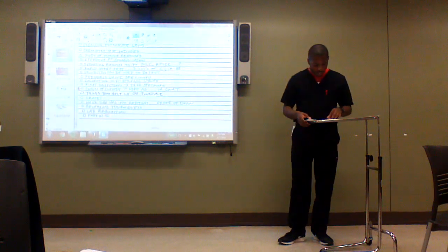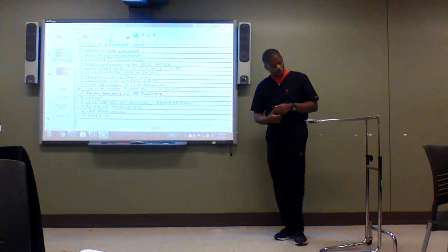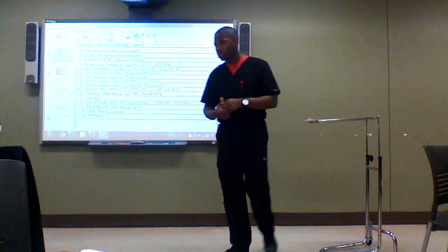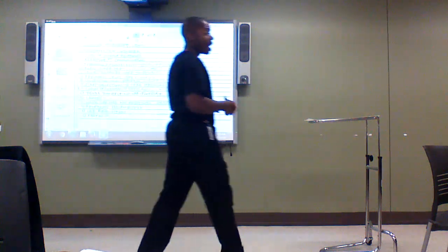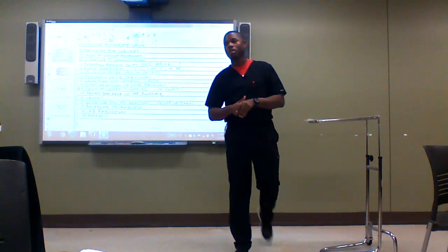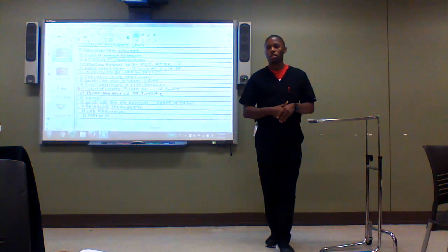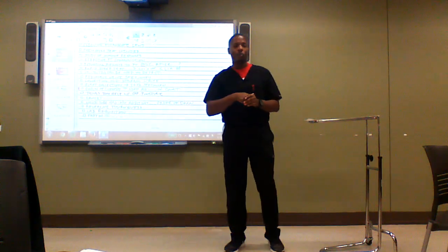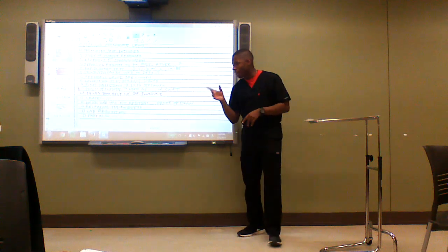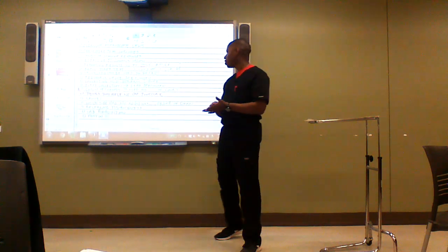What's one thing? Which tube has no additive? The red tube. The small red tube, the one with the thick little red leg. Oh, no, it's yellow. It's considered yellow though. No, yellow also doesn't have additive. That one's sterile. But red particularly is the answer to this. No additives. You already know order of draw.